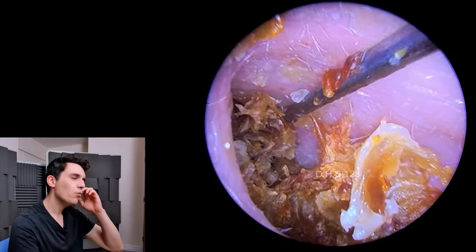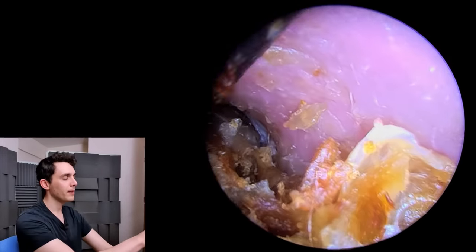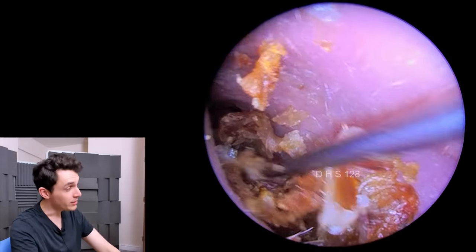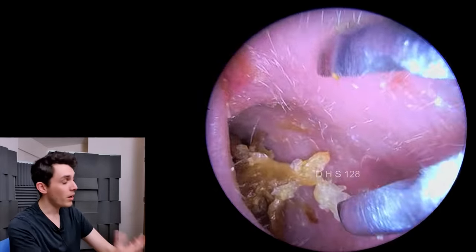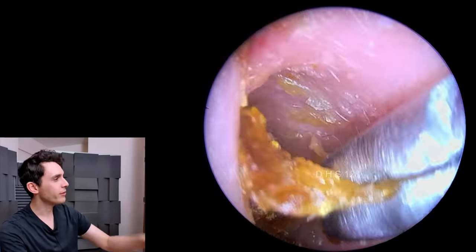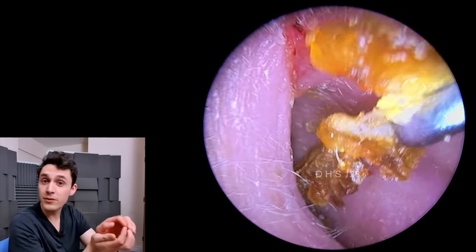As to why this has happened — usually when we see the vast majority of the debris is dead skin, the general kind of vague answer... These are biopsy forceps, by the way. I thought these would be a really great purchase — biopsy forceps which are basically like crocodile forceps but the jaws are cupped.